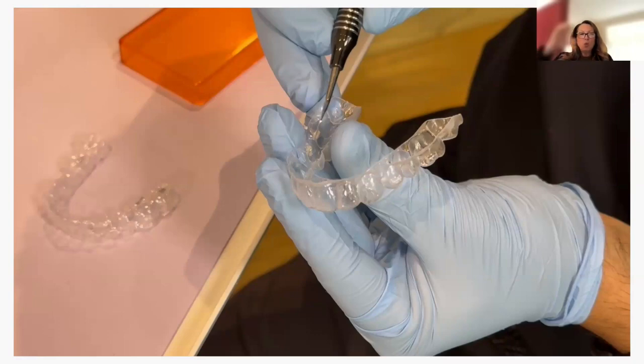Think of it as putting water in a glass, right before it starts to overflow, so you have that little slight bubble. That's how you want your flowable. For your packable, you want to make sure that you have it packed in there really nicely, and you don't want it overfilled because you're going to have a lot expressed out, and that takes more time to clean up.